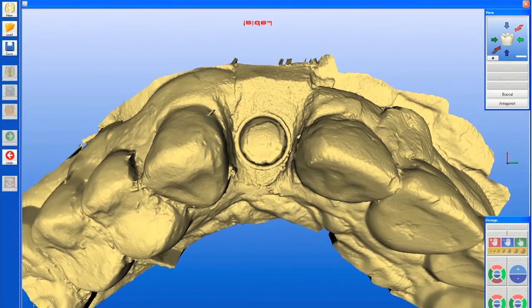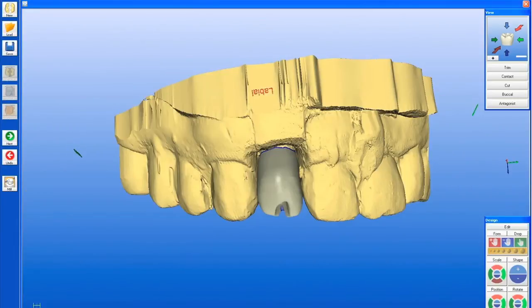Here we can take an occlusal view of our preparation, which is a temporary abutment. Just like normal CEREC technique — if this were a natural tooth, we simply draw our margin and move forward. Here we've used biogeneric software to design our tooth. The biogeneric takes a look at the adjacent teeth and designs a restoration that looks and feels like it should belong in that area, using mathematical principles.